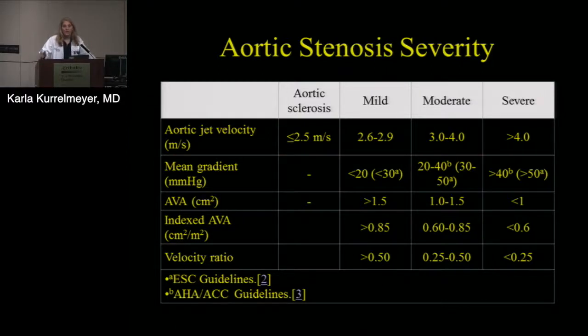Is that a legitimate DVI? Can you classify people as severe based off the DVI? Yeah, absolutely, you can. Yeah, that's true. You don't always get a good jet. And I think it's helpful, but it shouldn't be the main thing.